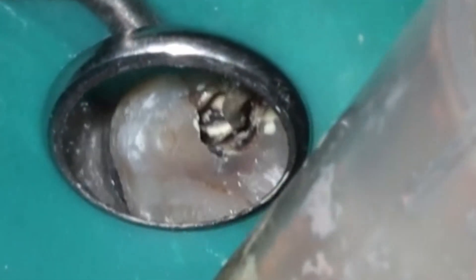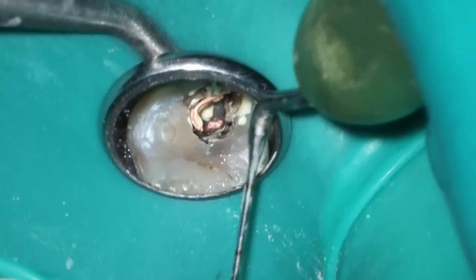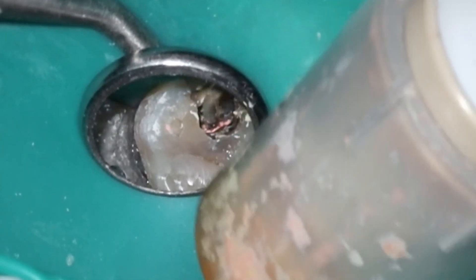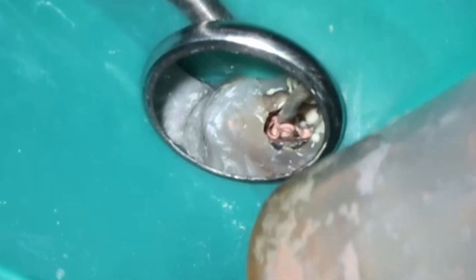If the joining point is higher than the tip, what will often happen is instead of the gutta percha continuing to flow down the main canal where everything comes together, it'll actually back up through the other canal and you'll get a short fill. The squirt technique is very effective — it's the only way besides Thermafil to get heated gutta percha to the apex. One of the times I will use cones is on really deep type II canal systems where they join, because I'll end up with a short fill. Sometimes the Pac-Mac can help; sometimes it doesn't. I'll usually try the squirt technique first, and if I'm still unable to get a good-looking x-ray, I'll remove the gutta percha with a heated instrument and a 20/06, then fill with a 20/06 cone.